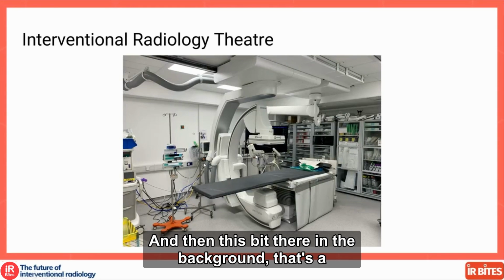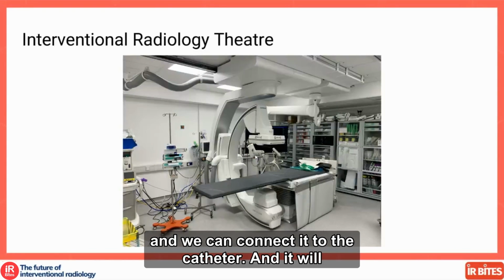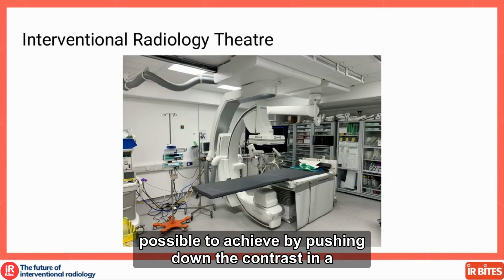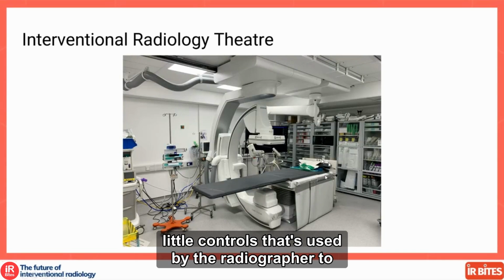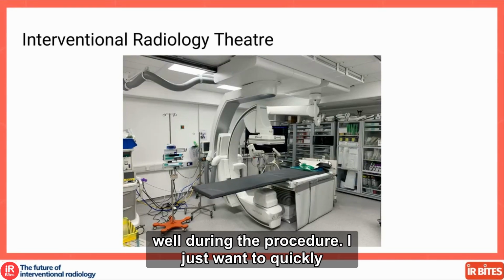And this bit in the background is a pump injector. Usually we fill that up with contrast and connect it to the catheter, and it allows the contrast to be pumped through at a much higher pressure than is humanly possible by pushing down the contrast in a syringe. Usually that will give you a much better angiogram. You can see there are lots of tiny controls used by the radiographer to control either the X-ray machine or the C-arm during the procedure.